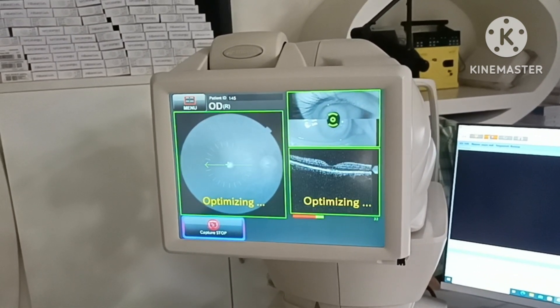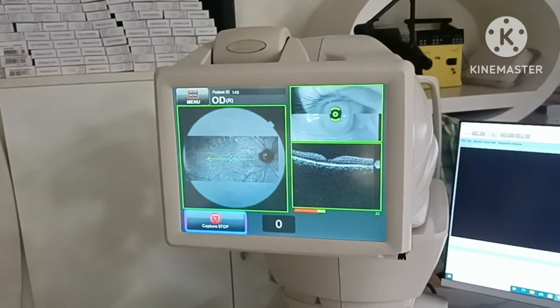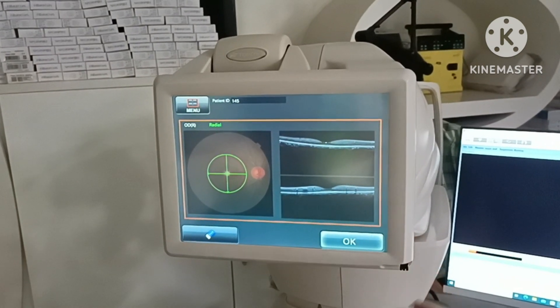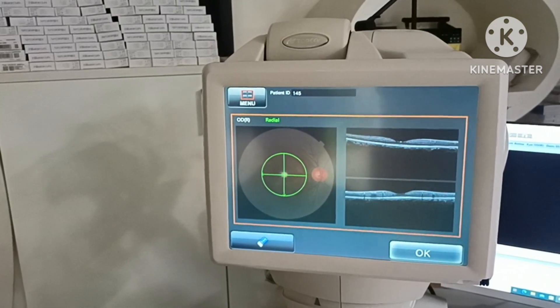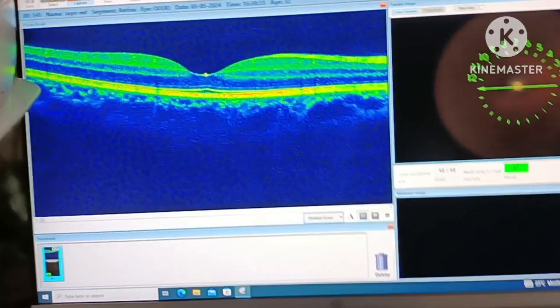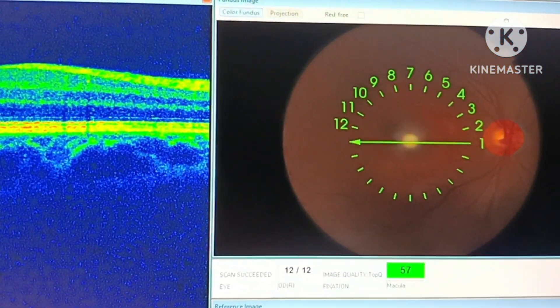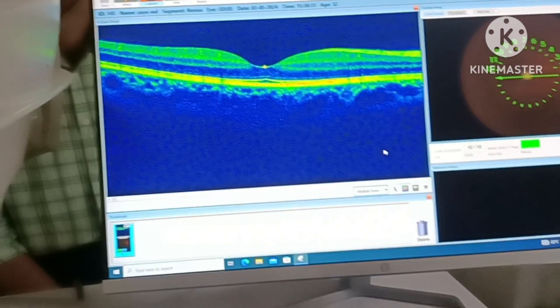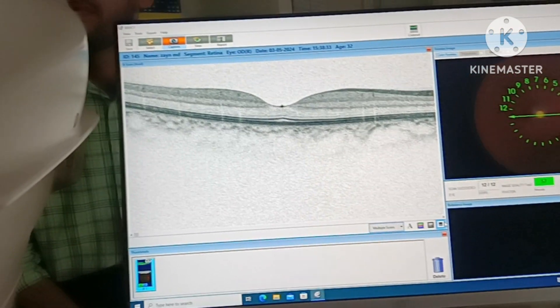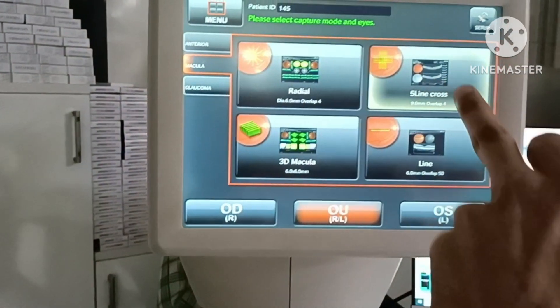Optimising — done. You can see here: 57% image quality, it's very good quality. Color, black and white, and night vision. Radial complete, now five line cross.